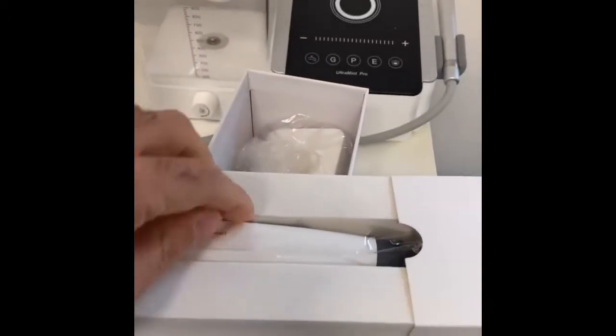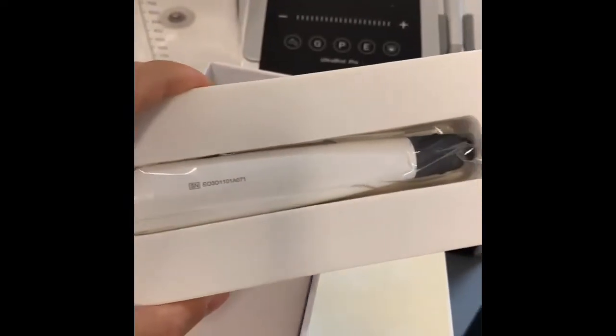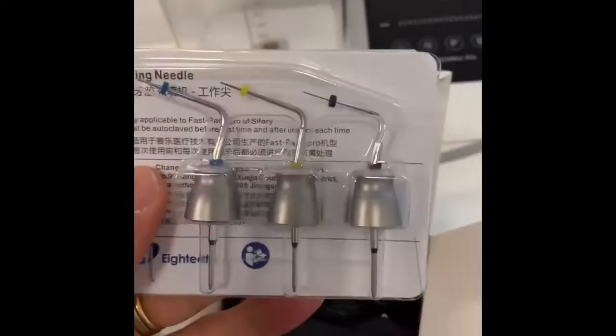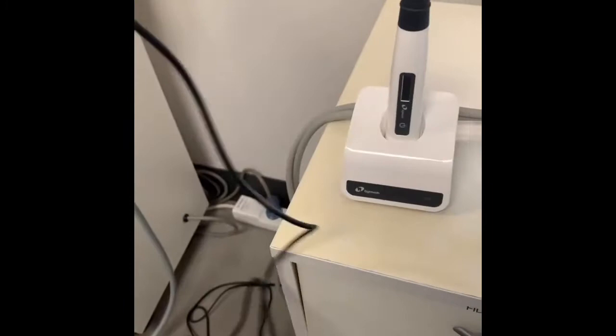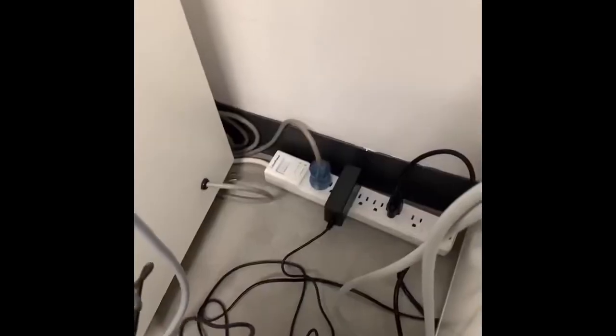So, this is the unit, and that's the charger there. The charging unit and the handpiece — these are the different tips in different sizes. Very cool. The charging cable and the conversion piece here. You just slide this in and it snaps in, and then you connect this piece to the back of the unit for charging. And it's on.